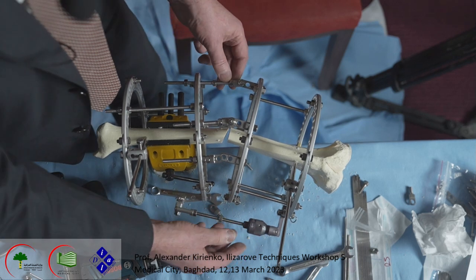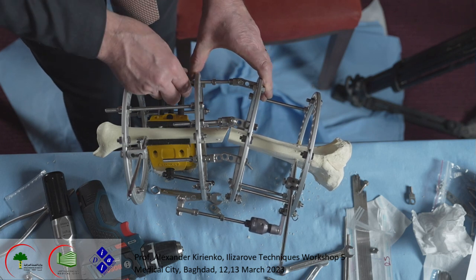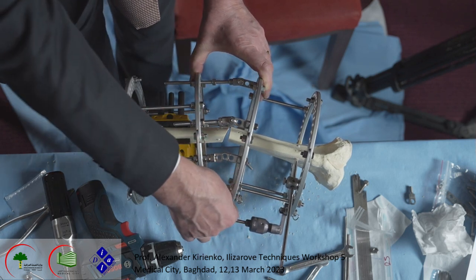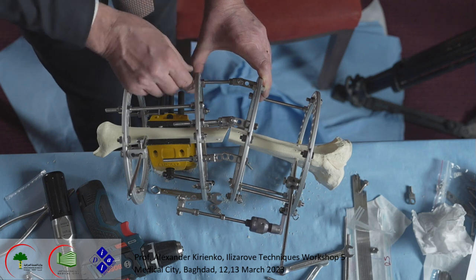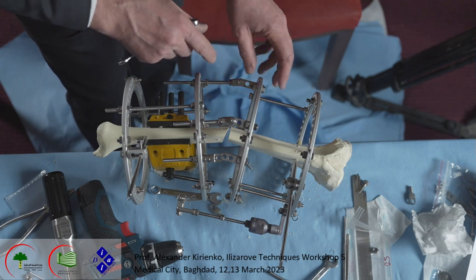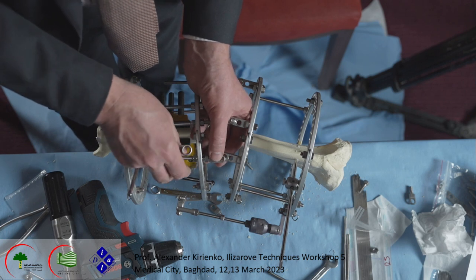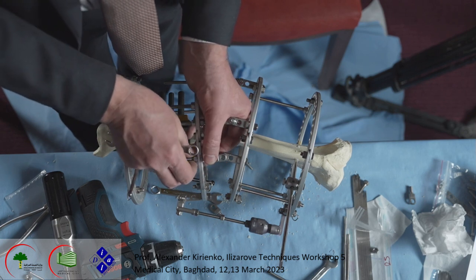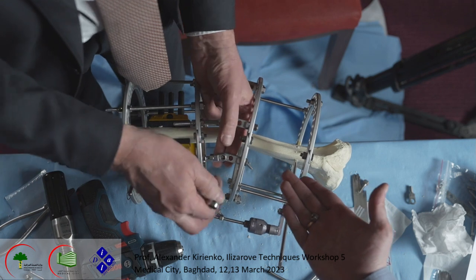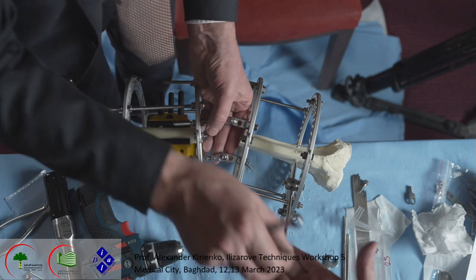Like you see here, my external rod is now shortened, it will function the same. If I do the same correction here, it will be functional, but the only problem is that there is no power. But it's possible with this system to use compression of the lateral rod function. Now you see my rod that was uncomfortable became working, functional. I put the bolt here because it is my hinge here.